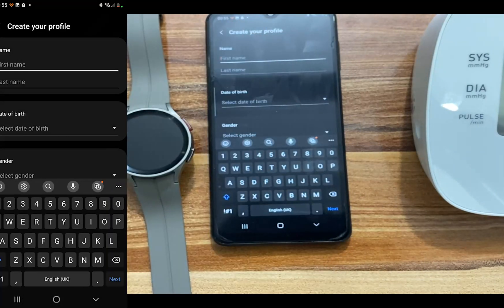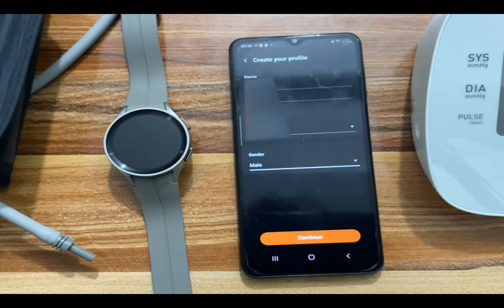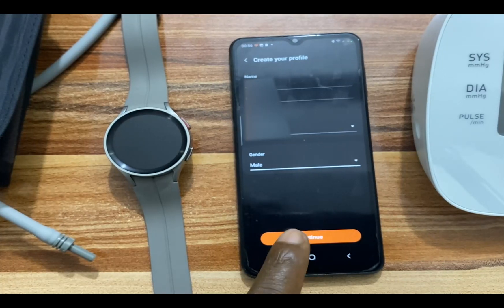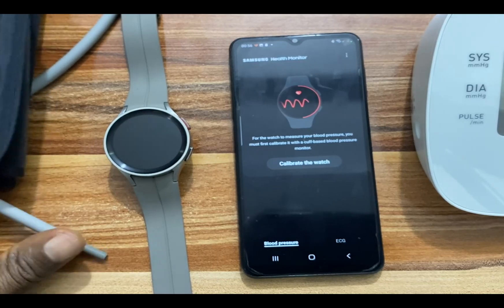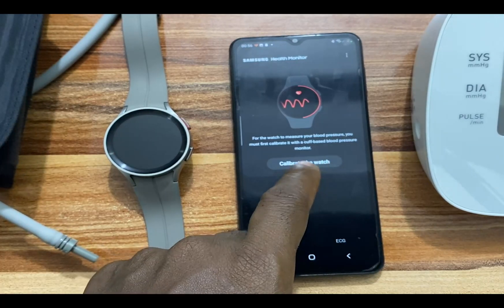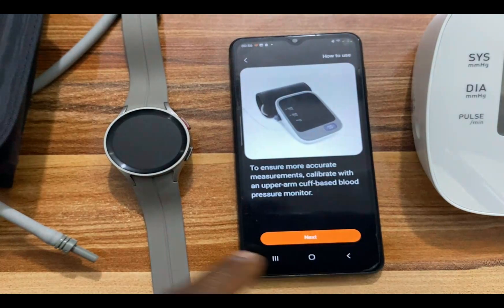You need to fill in your details here to create your profile. Once you are done, tap on Continue. It says for the watch to measure blood pressure, you must first calibrate it with a cuff-based blood pressure monitor, which is what I have here. Tap on Calibrate. You will need a valid blood pressure monitor, follow instructions within the phone app to take three measurements, and you will need to wear your watch during this time.